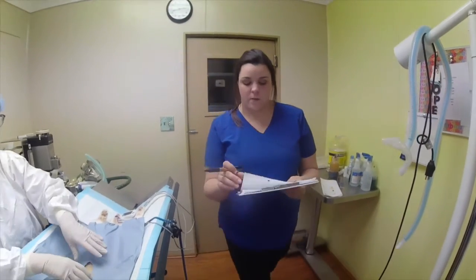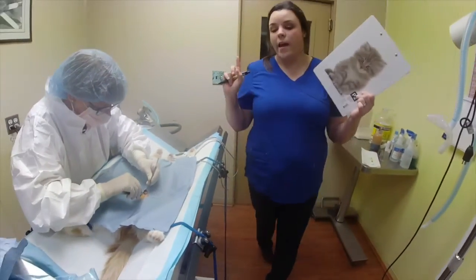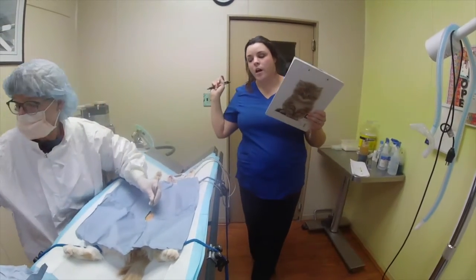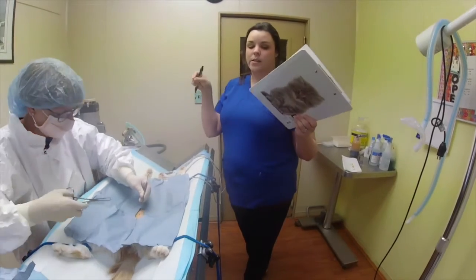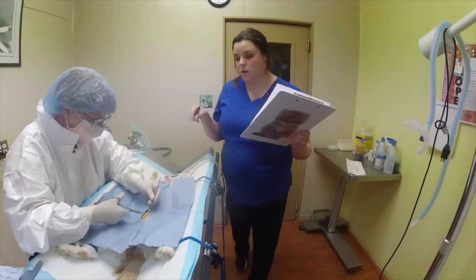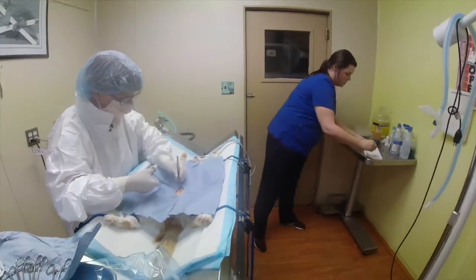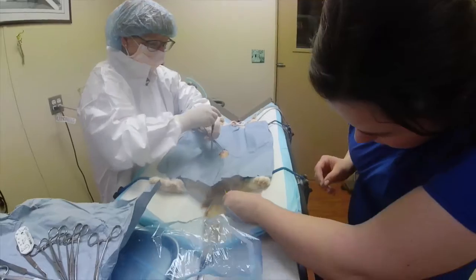Okay, so to keep a record during surgery, you can just go. Our temperature, every 15 minutes, we don't have a thermometer that stays in during surgery. So we take it every 15 minutes, and the rest of the vital signs every 5 minutes. So I will go ahead and do the temperature. And you want to make sure that you don't get in the way.